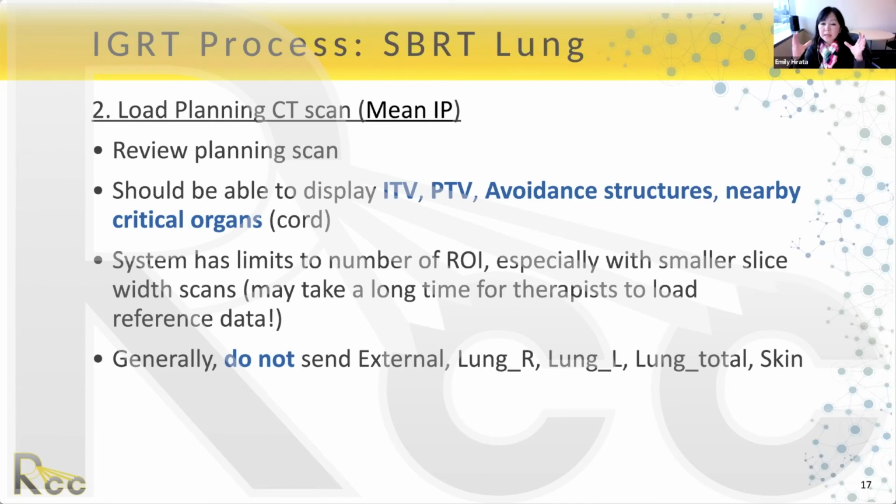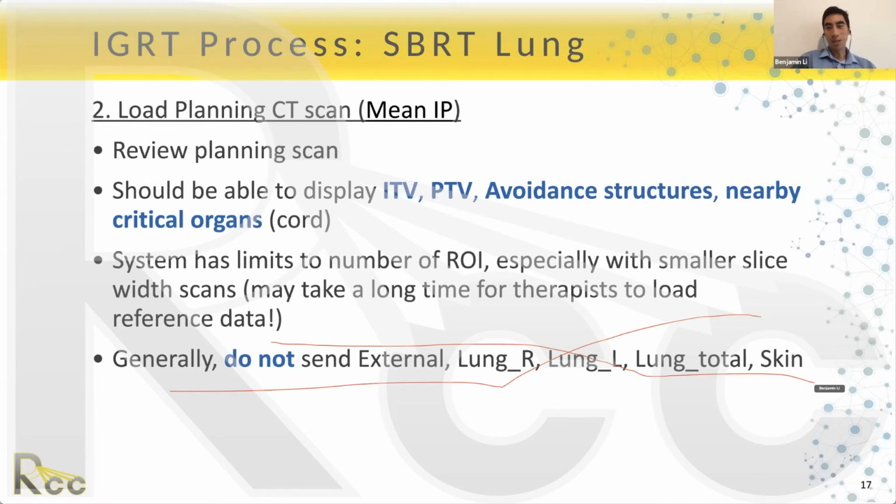And the control console sometimes hits a limit in the amount of data it can load, and then you might get an error message. And so this is just something that I want to share with you from my own experience, that if you can advise your planners, or if physics is doing the planning yourselves, you really want to not send these structures to the console. So don't send these ones. These are huge. They'll slow things down.